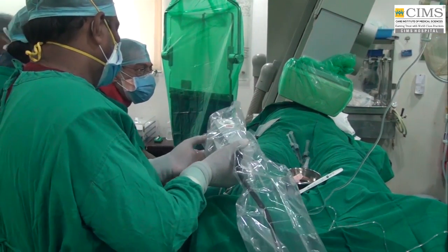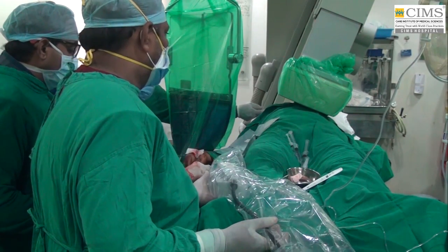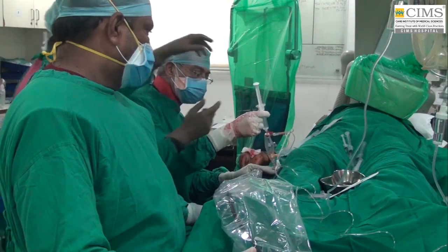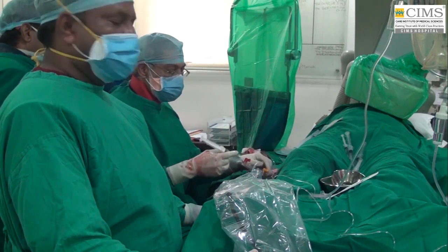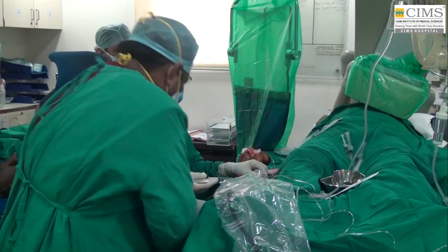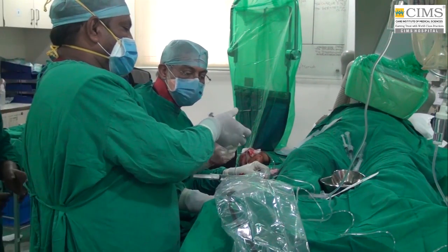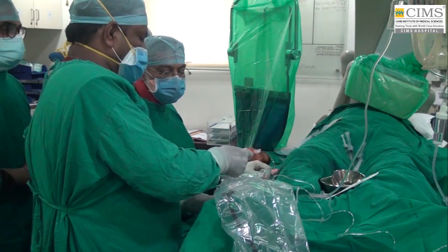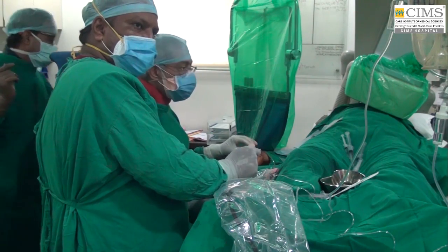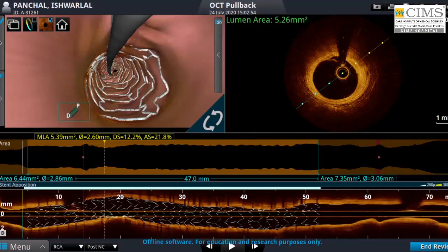So now we'll have another run of OCT and check the final results, hopefully the final results. So let's get ready with our OCT and prepare a 20 cc syringe. So Vipul, why don't you wind up and tell us what we have found in this run, presumably final.